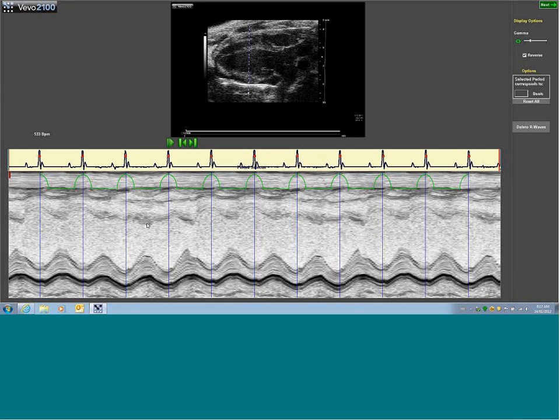You can see at the bottom here is clearly the anatomical M mode of my left ventricle, and it's showing me the different cardiac cycles. This is now where I'm going to want to select the cycles for analysis. But an important note is that you'll want to avoid any areas where you know the animal has taken a breath. As you can see in this image here, there's a little bit of distortion at this section of the M mode and here as well. What you know is this is where the animal has taken a breath. So I'm going to want to avoid analysis in this area.